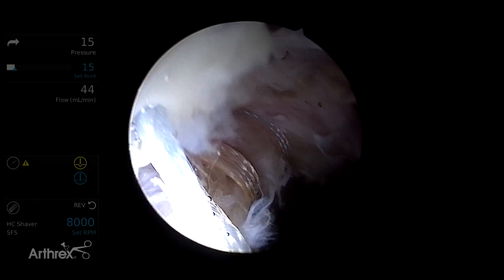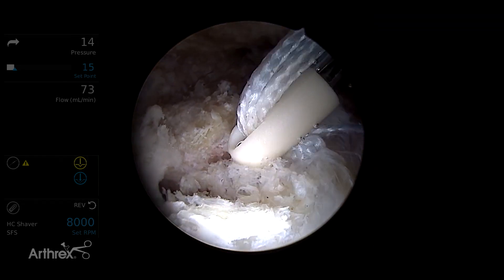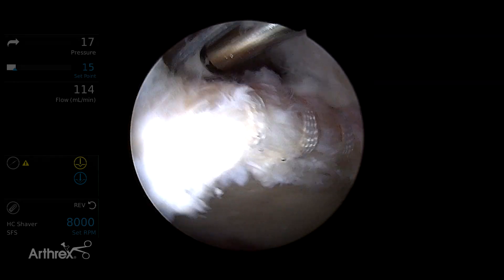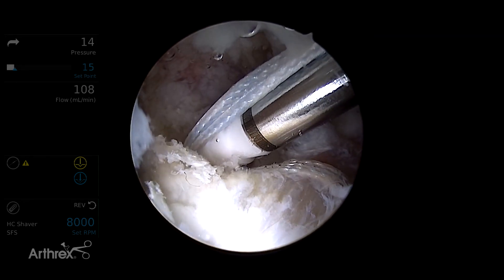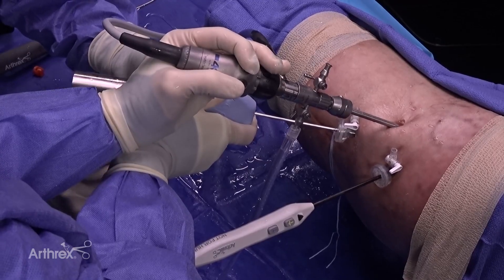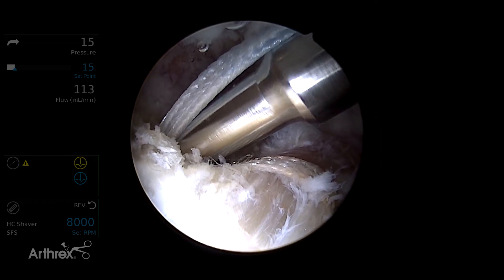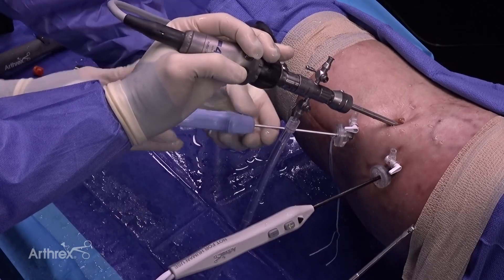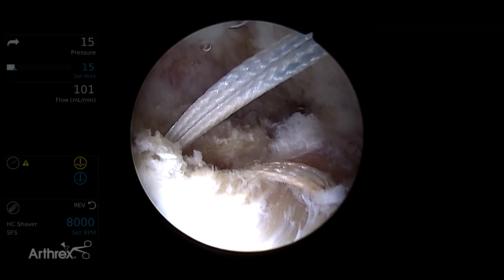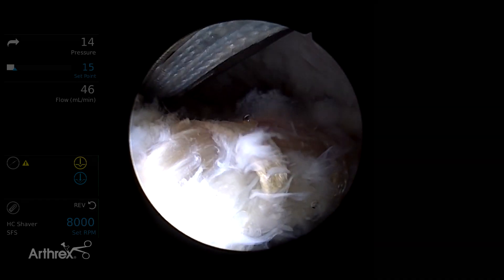The anchor is slid down in the appropriate position, identifying the placement of the tape and the pre-drilled anchor position. It is then tensioned correctly and final security is confirmed by malleting to the laser line. Hearing the sound change confirms the appropriate position. The inserter is then unscrewed, removed, and the final suture is cut flush.